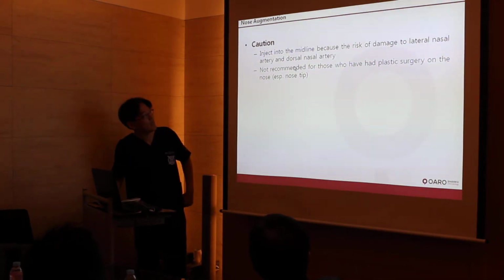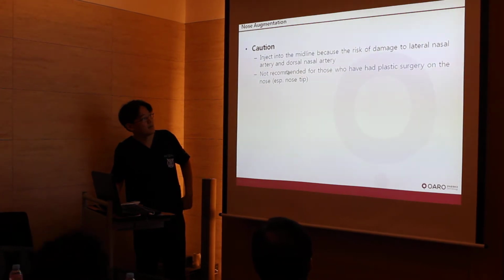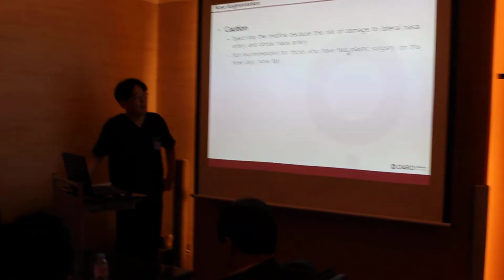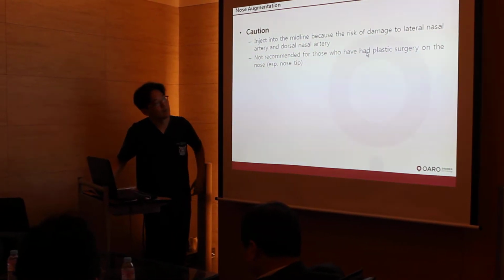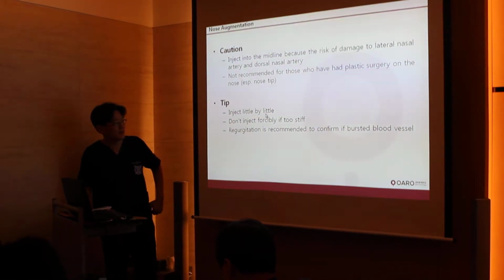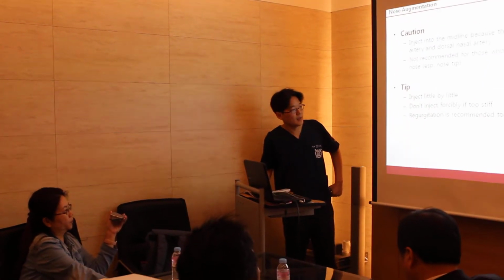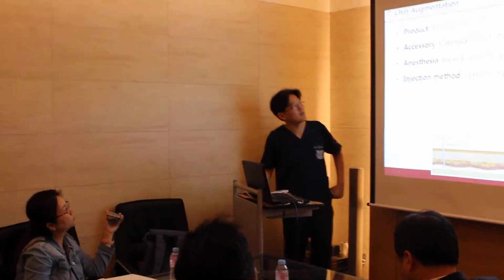So try to inject filler into the midline, and if patients already got plastic surgery, filler should be injected very carefully because that means the vascular supply is not enough compared to pre-surgery. So inject little by little and don't inject forcefully if too stiff. And regurgitation is recommended to confirm a burst blood vessel.